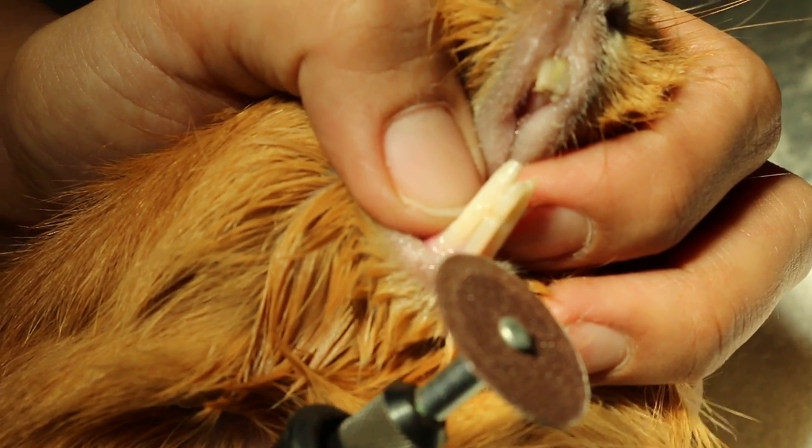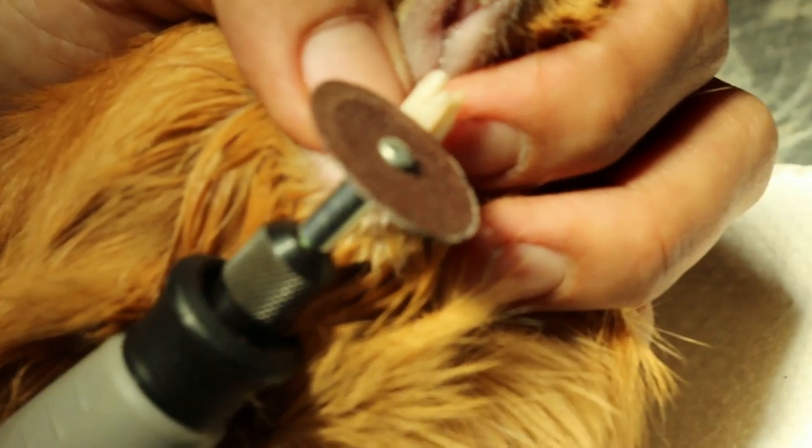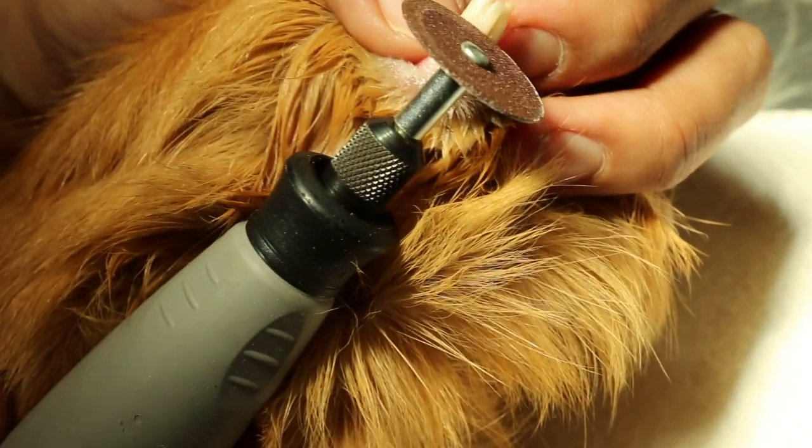Now we are going to do it. Normally what we do is slowly — you okay? Yes, now. We just do slowly the lower setting. The lower setting.